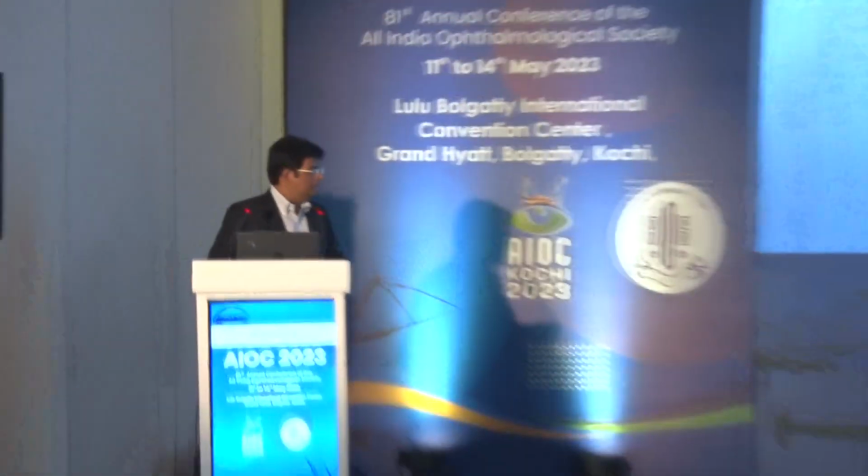The reason why I asked this question was that I did a study, which has been published now, one of the theses of one of my candidates. We compared the Indian hydrophilic acrylic phakic implant with the ICL, and we compared the visual outcome. We found that on Pelli-Robson, the contrast was comparable in both groups. But in MTF, the ICL group fared better.